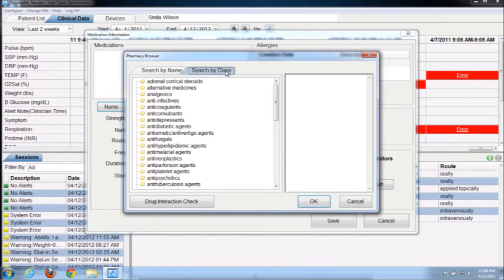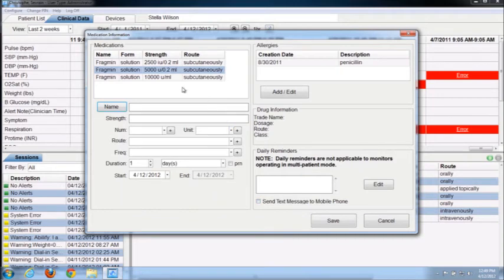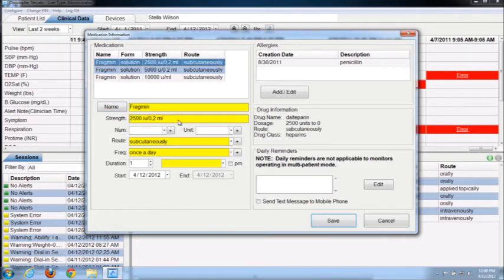In this example, if an anticoagulant is sought, the system will list the various families and specific drugs. Then by selecting OK, the particular drug will be moved to the patient prescription window, and selecting a dosage level from the list will automatically populate fields which can be overridden by the user as needed. The system also looks for drug interaction or patient allergies and will warn the clinician if any potential drug interaction or allergy issue exists with that newly prescribed drug. This drug database is automatically updated monthly by the system.